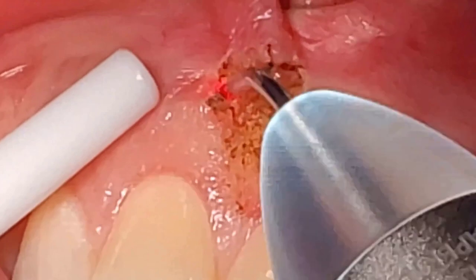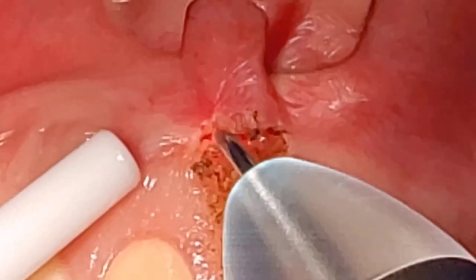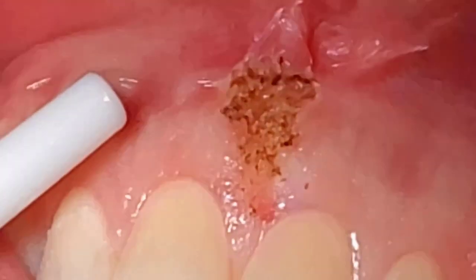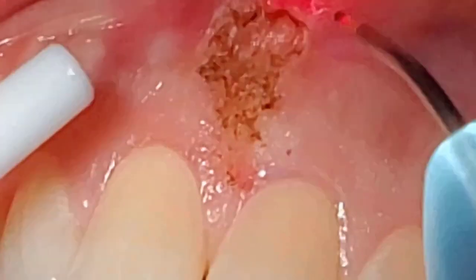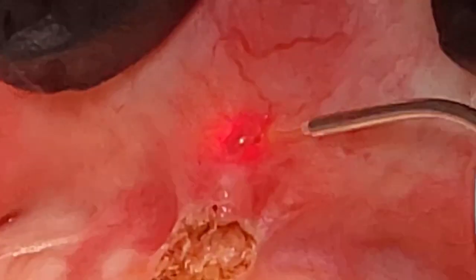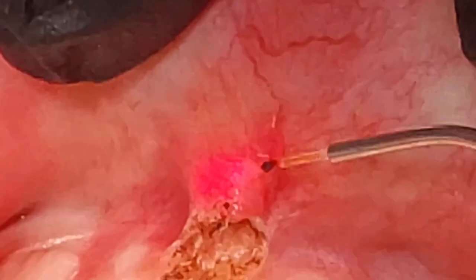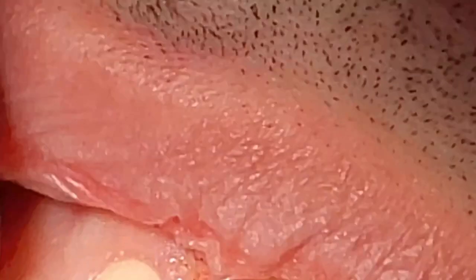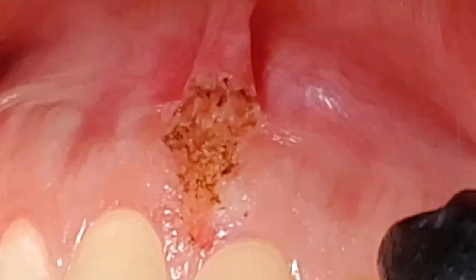We're going to stop and just look, evaluate where we are, remove the groove director, and see what we've got going on. Notice we've dissected up the frenum. There are two things going on here. You see even a little accessory skin tag here, and that probably was from when he had a space and the tissue flopped in. But take a look real quick at what we've done. The frenum is still there, so I'm still going to have to dissect that.